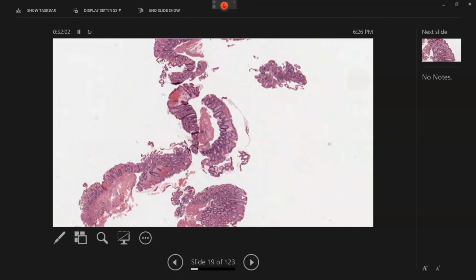Like, do all these segments within this biopsy, do they all look the same or do they look different? So what are your views on this low power? What do you think? Tell me your opinion. Do you think they all look similar from top to bottom, from left to right, or are there differences between areas? Different. You are absolutely correct, right?